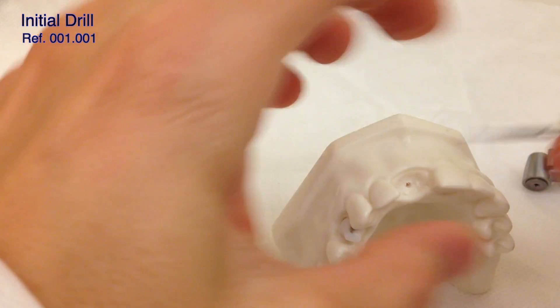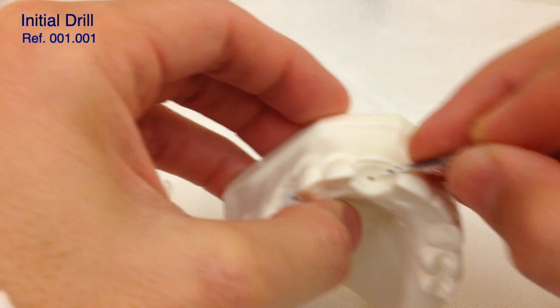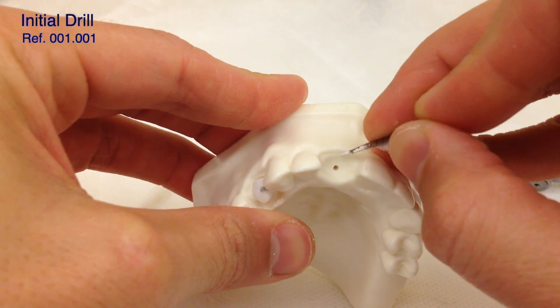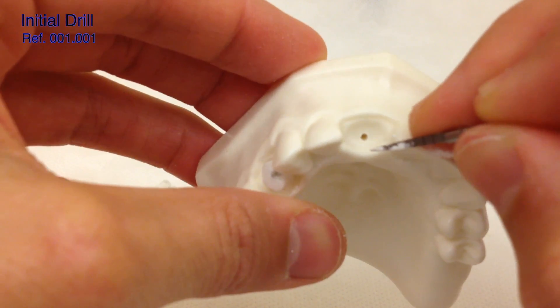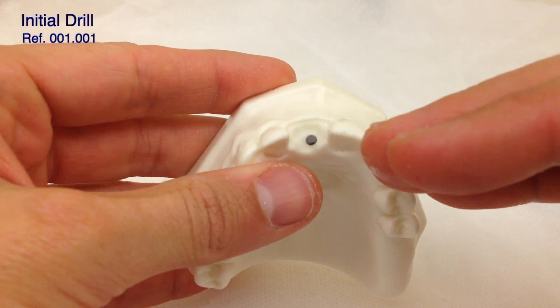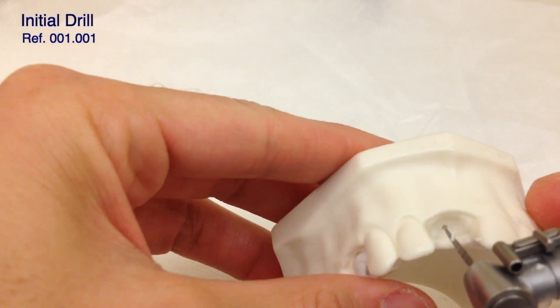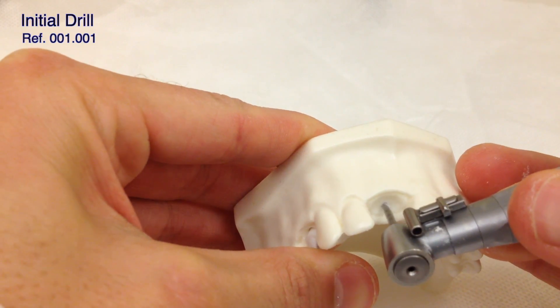Then we check the direction again. It's important to see that our drilling area is exactly at the same distance to the buccal bone and to the palatal — every time we should try to have the same amount of bone. It looks like we can go a little bit more towards the buccal, about half a millimeter more. The direction of the drilling is pretty much correct, so we're just going to move the drill slightly more buccal without changing the direction.